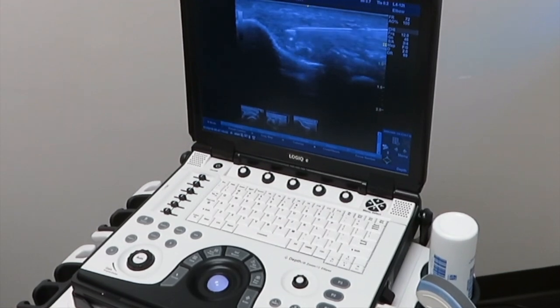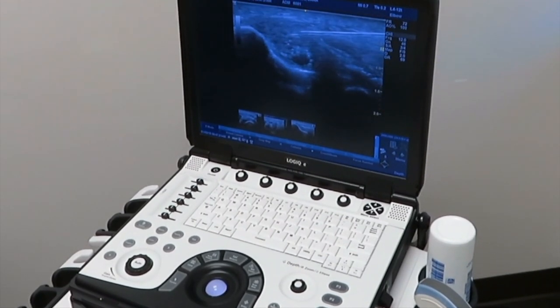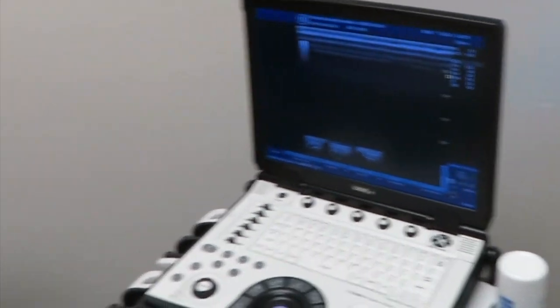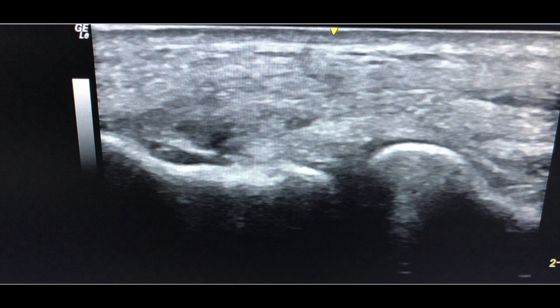Let me see how it's extending the tear. All right, my man — how about was that? Not bad at all. Here's a screenshot of that associated tear with the tendonitis.